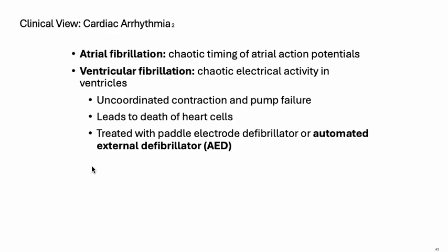So with atrial fibrillation, and I'll show you an image here, you'll see irregular activity where you would expect to see P waves, but you'll still see QRS complexes. You'll see no discernible P waves, because in this case it's the atria that are acting abnormal. For VFib, ventricular fibrillation, you really won't see anything, right? It's chaotic electrical activity in the ventricles. It's uncoordinated. This is not life-sustaining electrical activity. Okay, so this is potentially fatal if not corrected.